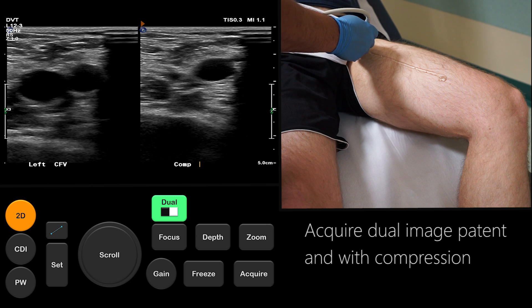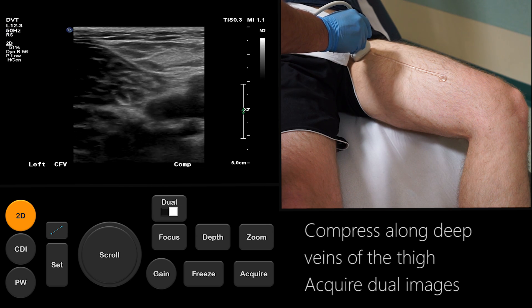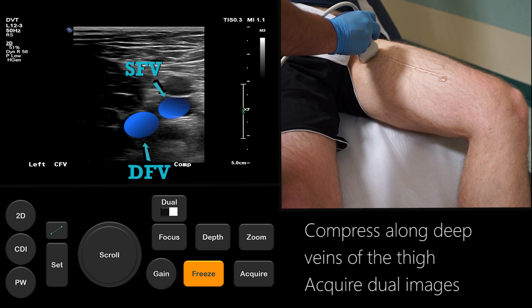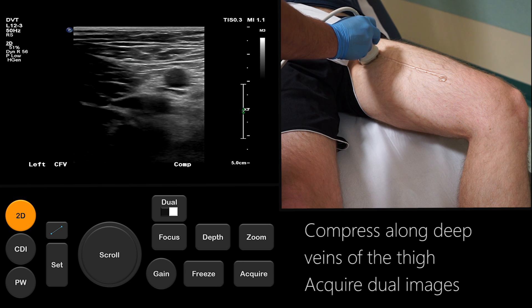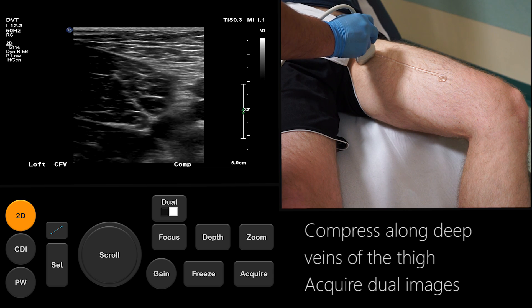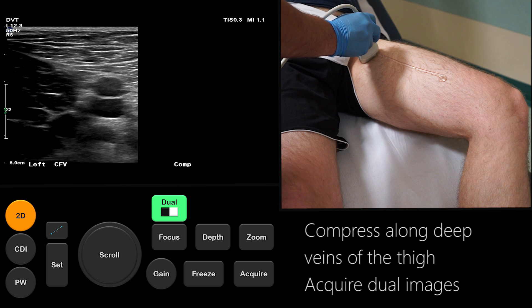Return to full screen and slowly slide the probe distally while regularly compressing the veins. The first branch of the CFV seen here is the deep femoral vein, after which the CFV becomes the superficial femoral vein. Acquire dual images demonstrating compression of the profunda and the proximal SFV.